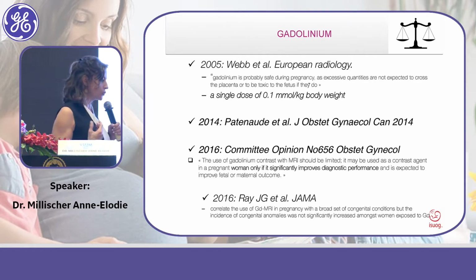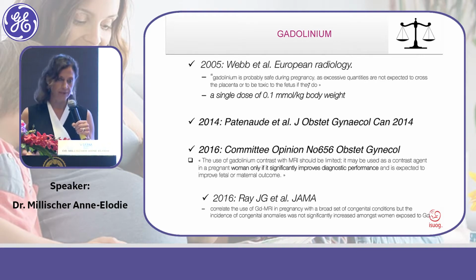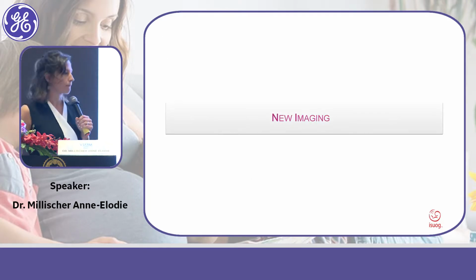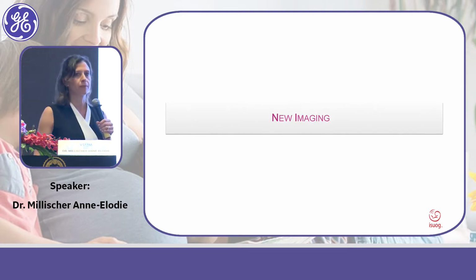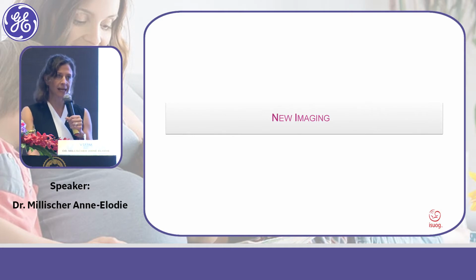the risk to do contrast in a pregnancy and the risk for the mother to have a placenta accreta. Và nhưng mà cái việc mà tiêm thuốc cản quang vào nó vẫn còn là vấn đề rất là tranh cãi, cho nên nhiều khi mình phải cân nhắc giữa cái lợi và hại của mẹ và của bé để có quyết định tiêm thuốc hay không. And just a few words to finish about the placenta and imaging.